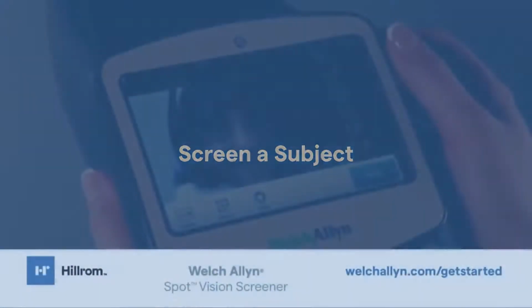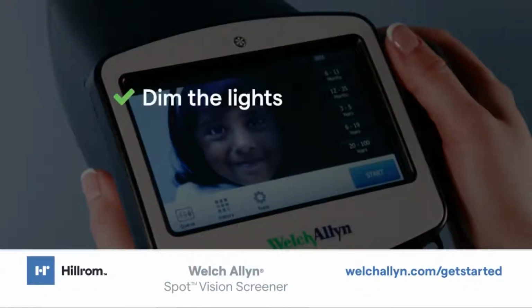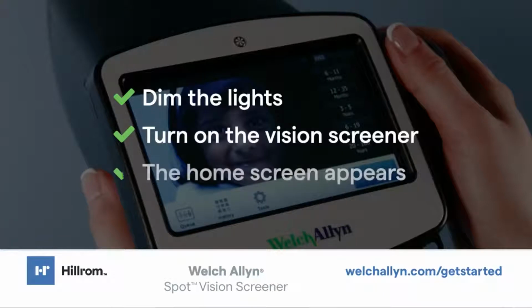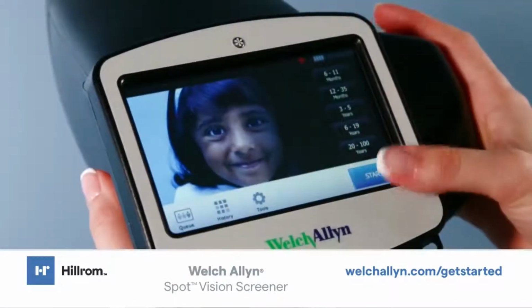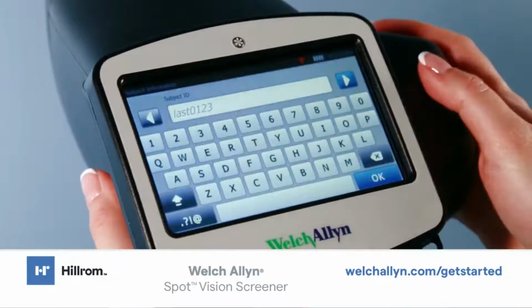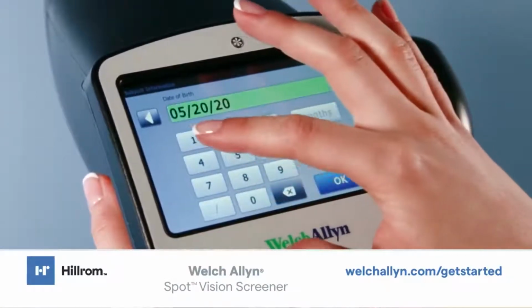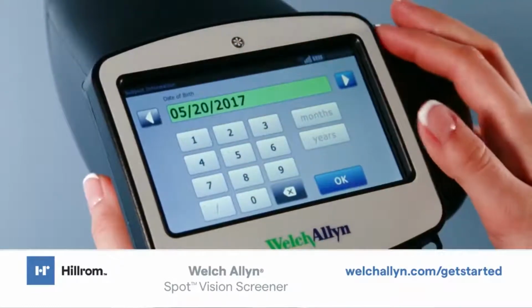Screen a subject. If possible, dim the lights. Turn on the vision screener. The home screen appears. Touch Start and enter the subject information. Date of birth or age is required. Enter date of birth or age in a valid format.